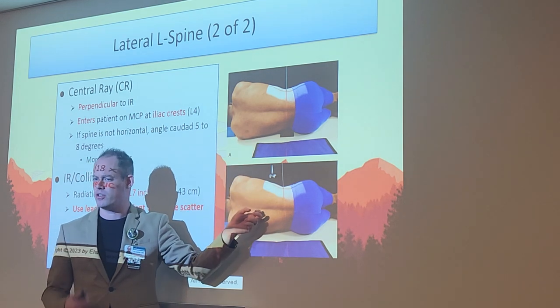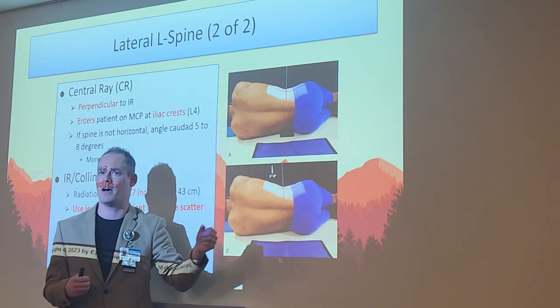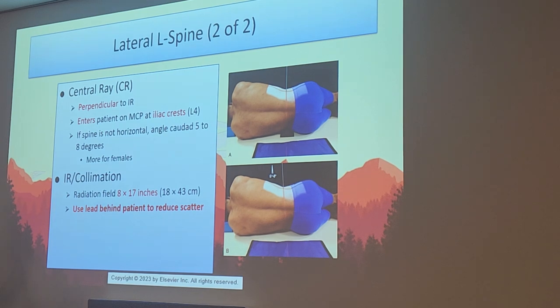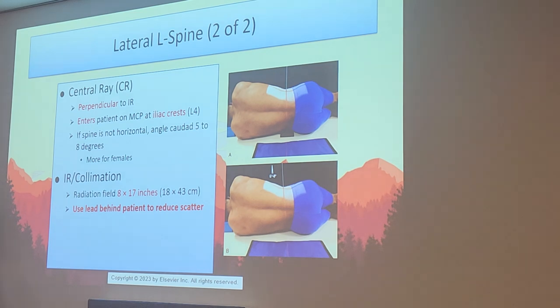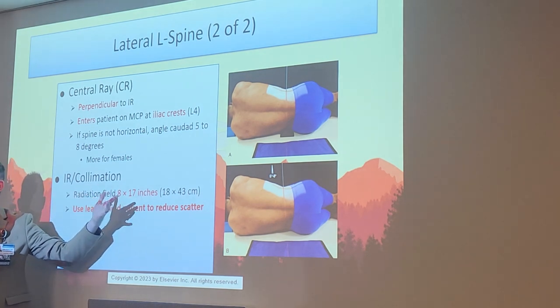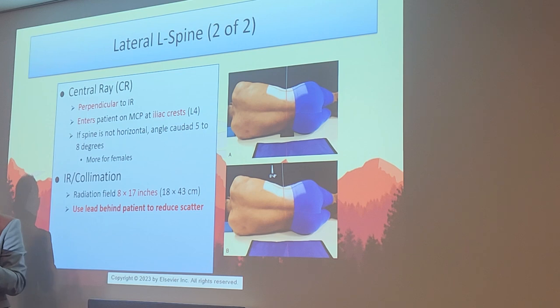So you don't have to do this, but if you're looking for that really hot shot optimal lateral spine, that can further optimize it if you don't build up their waist on the table. That would be a 5 to 8 degree caudad angle, kind of similar to what you do with spot film. Slightly more for females, because females naturally have wider waists than men, but that's going to help give you that nice, straight, beautiful, true lateral L-spine. You're going to avoid some of that natural curvature of the spine. Like I said, guys, lead shield behind the back to help reduce that overall scatter, optimizing that image quality. Make sure your collimation is at minimum 8x17, just like with the AP, to once again boost up the overall quality of the L-spine.